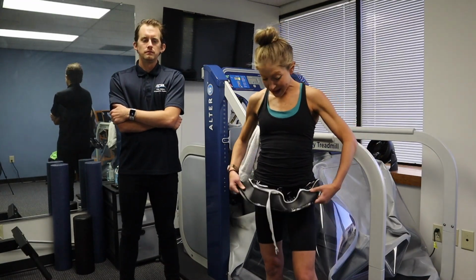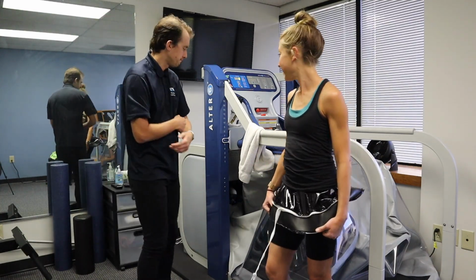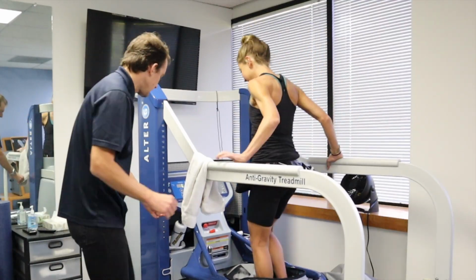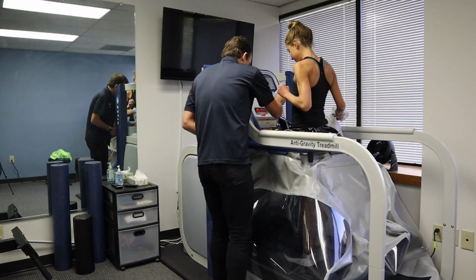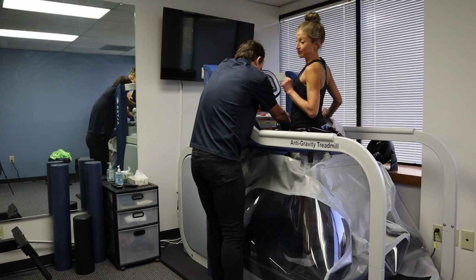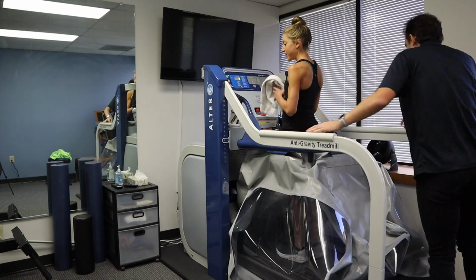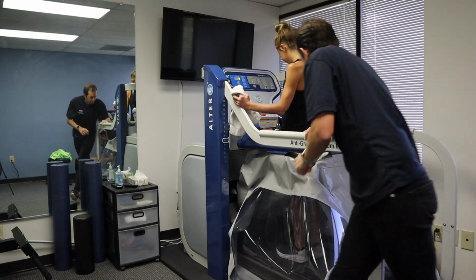All right, friends, so I've got my spiffy AlterG shorts on, and she's ready to go. So let's get her hooked up on the machine. All right. So it's got to be lowered down to the ground here, and Caroline can step right there and then inside the machine, and I'll raise the support bar here up to roughly hip height, and we'll zip you in here. Now, if you didn't know this already, the AlterG was developed by NASA. And it was actually developed to add weight on, but something happened and it took weight off. It did the opposite. And so now here it is helping runners and active individuals and non-active individuals run, which is pretty awesome.